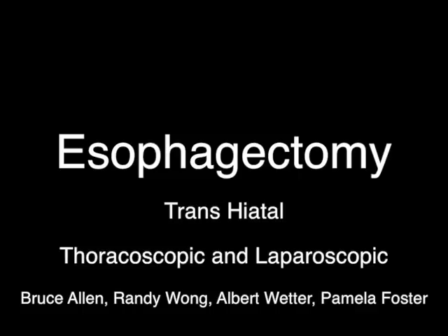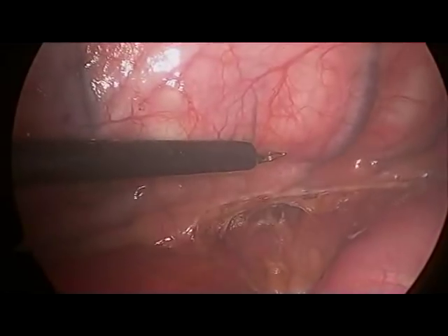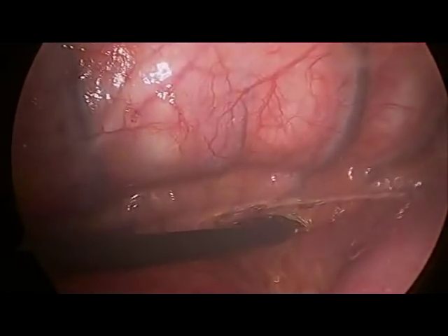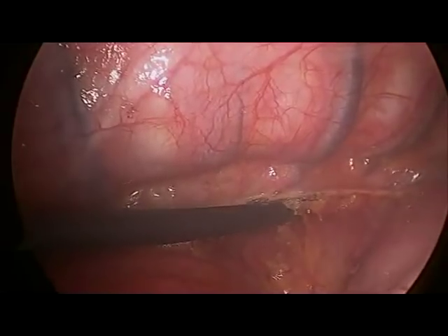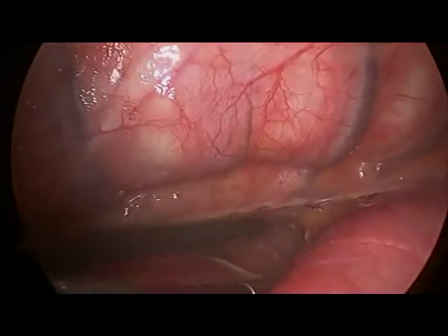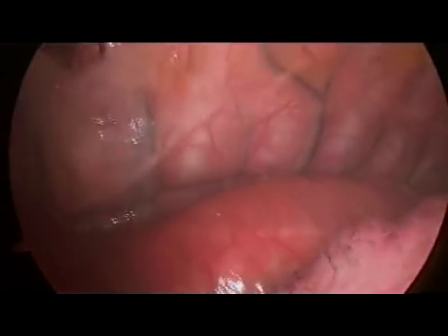The video demonstrates the excellent exposure of the esophagus that can be achieved by placing the patient in a prone position. This position allows a safe and more precise dissection of the esophagus. The operation begins with the patient in the prone position. Trocars have been placed in the right lateral and posterior positions. Here, a dilated esophagus is seen between the spine and the lung.